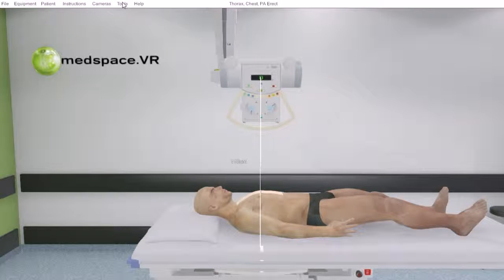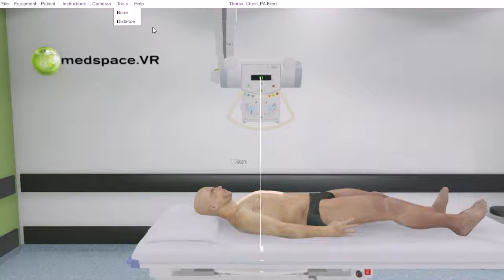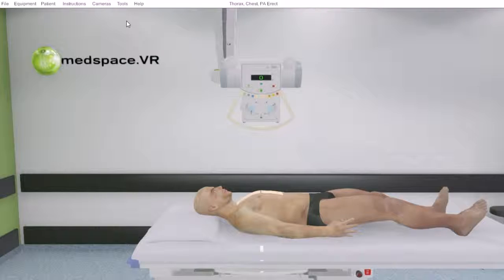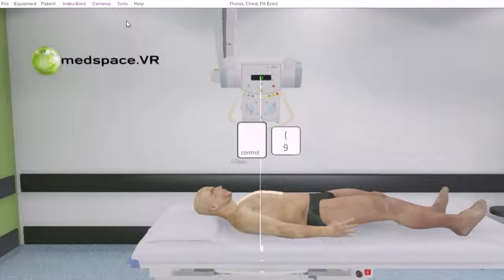This tool can be turned on by accessing under Tools the distance option, and then it can be turned off in the same manner. Also, Control and numeric key 9 will also give that access.